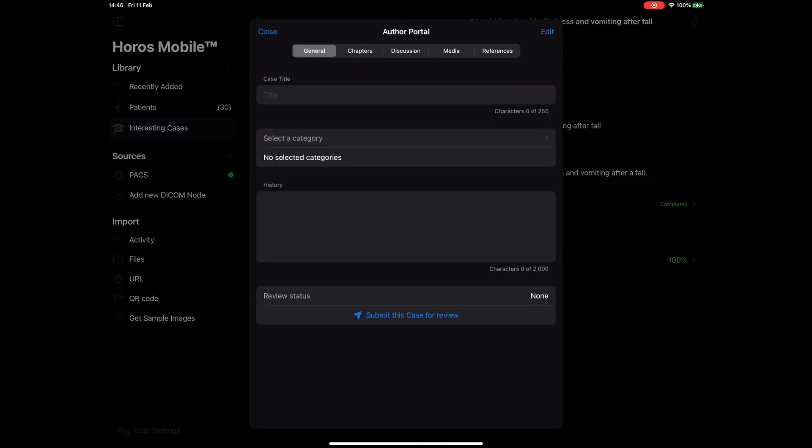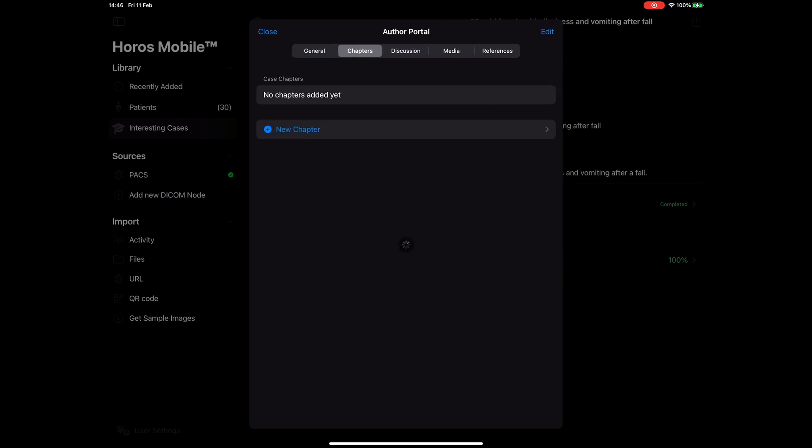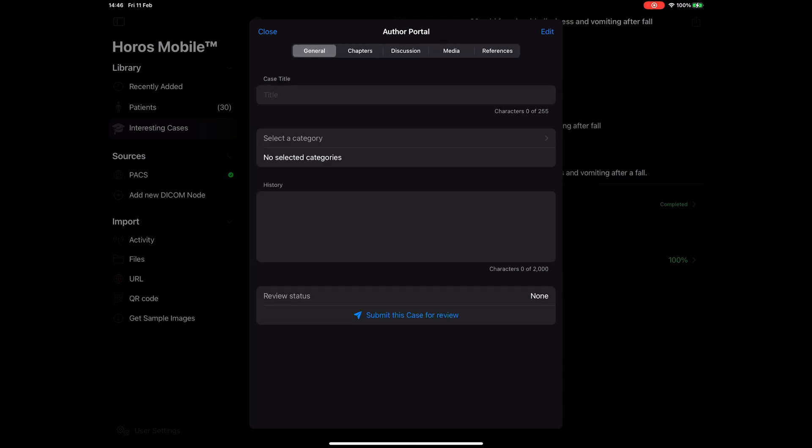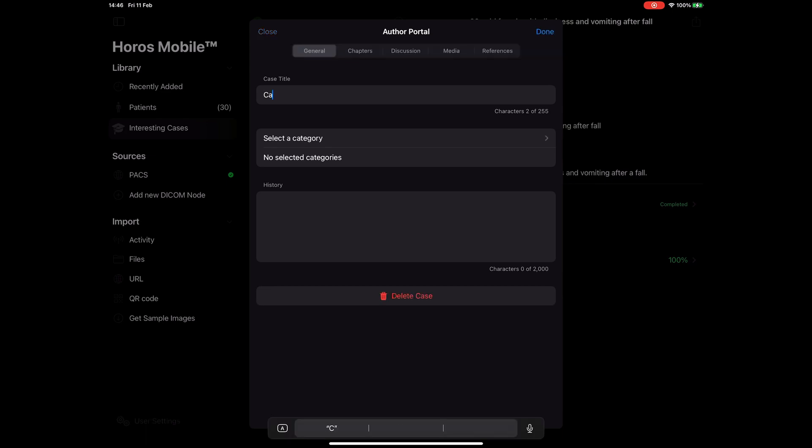We made it super simple for you to create, review and submit your cases to the community. In this view you can see five different tabs that all describe different parts of your submission. The first one is the general tab. Here you can set a title for your case.